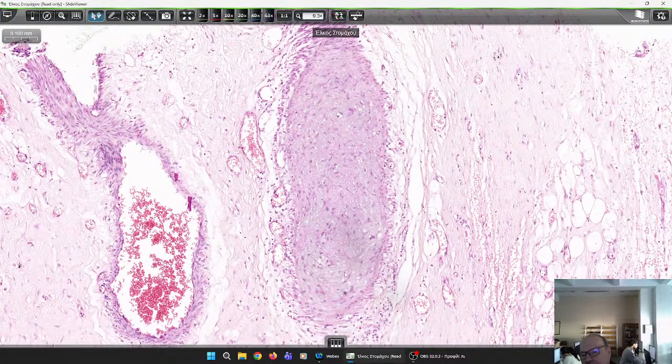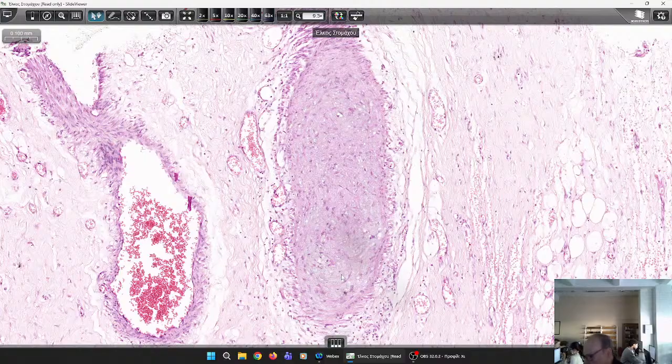This seems to be an artery, and we don't see a lumen, but I do not think it is so specific because it might be a matter of how it is cut and not see the lumen. However, I think that the wall is very much thickened. Why? Because of the chemical mediators secreted by the inflammatory cells in the ulcer.